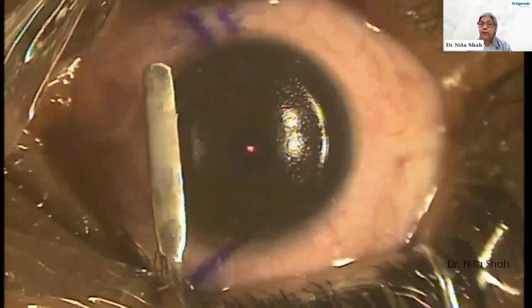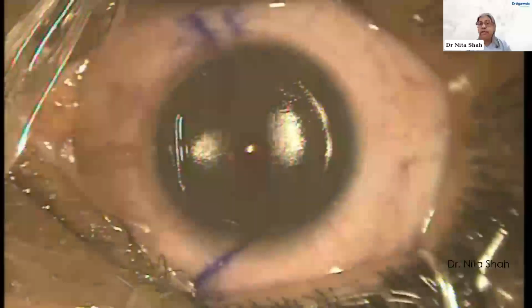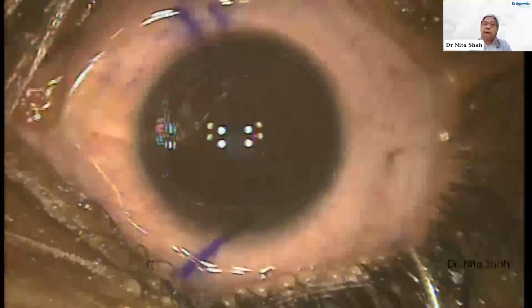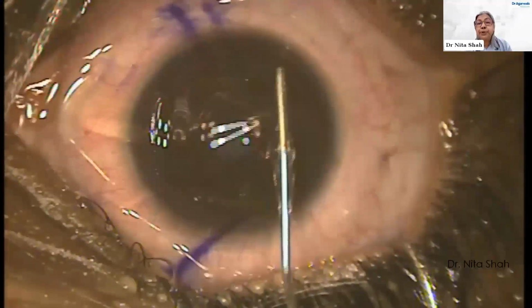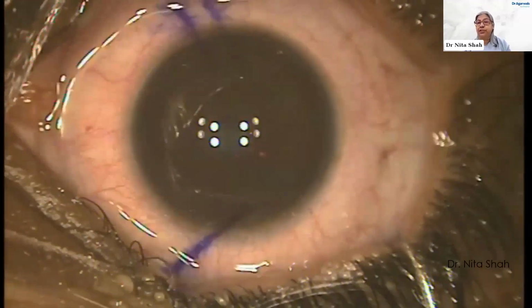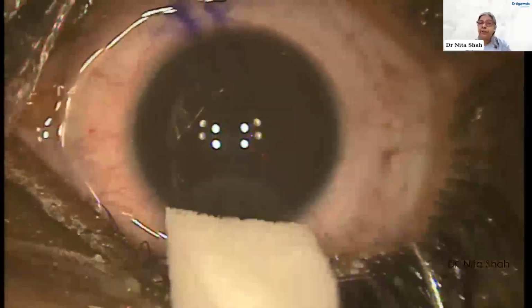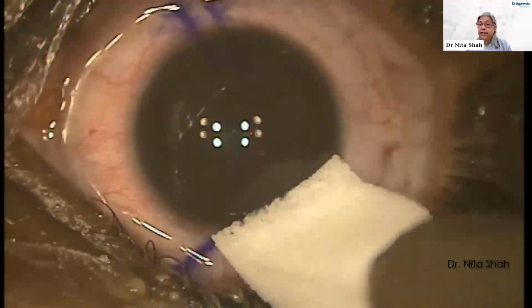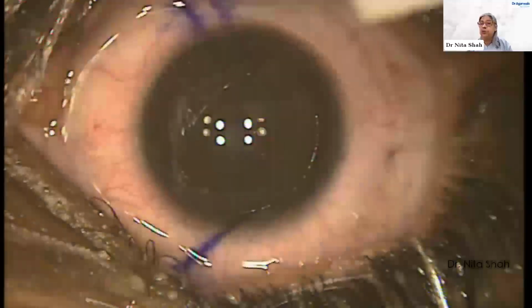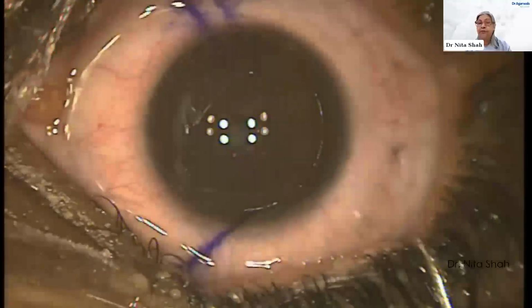And then the laser is applied to take away whatever power the patient is having. And then once that area is washed and cleaned of whatever cells are disturbed, by and by, we can take the flap and position it back in a way by which it sticks to the cornea without any stitches. It takes a couple of minutes for it to stick, but as you can see, the patient is totally comfortable. This is an unedited surgery which I'm showing you. And again, it takes a few minutes for us to do the surgery in one eye. And it goes off quite smooth without any pain or discomfort.